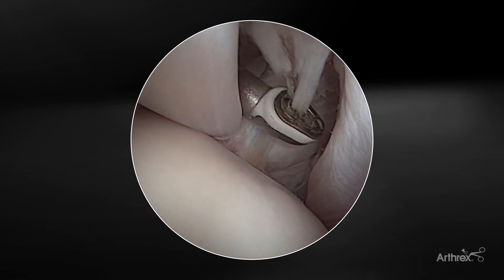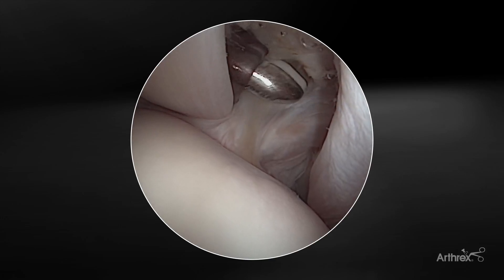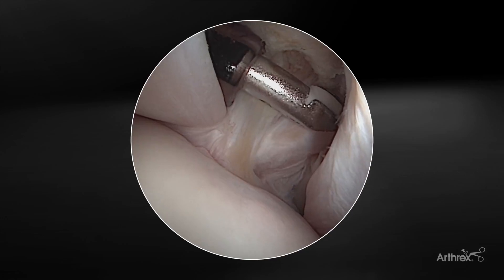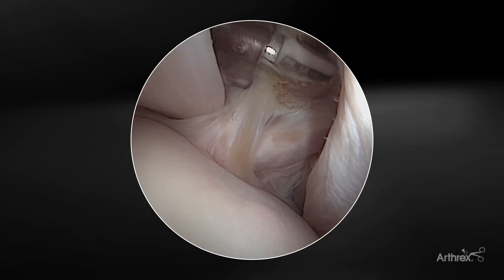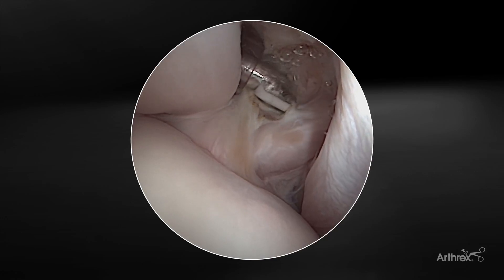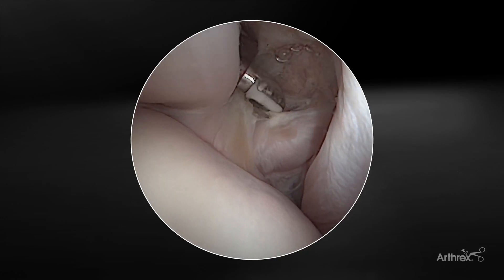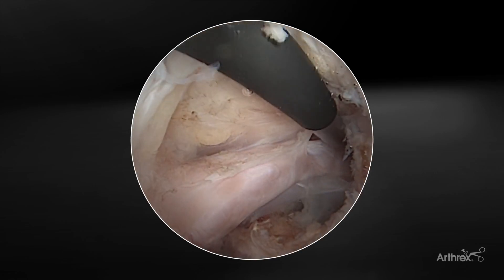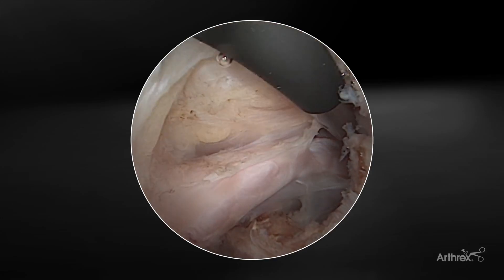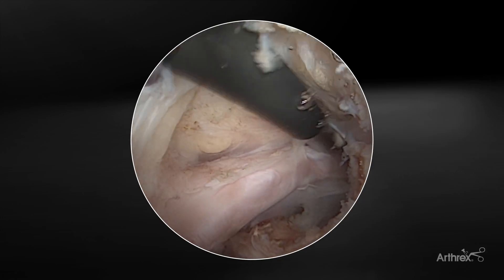As we move more superiorly above the subscapularis, if you wanted to do a rotator interval release, due to the geometry of the electrode, it's very easy to work in the planes above the subscapularis and remove some tissue in this region — if you're going to be performing a subscapularis repair or performing a release anteriorly. As we're working more medially on the subscapularis, you can see some medial adhesions here towards the medial aspect of the rotator interval, getting towards the base of the coracoid.